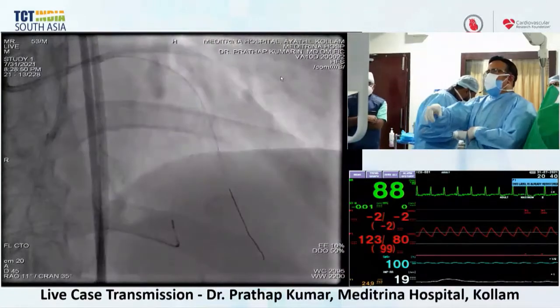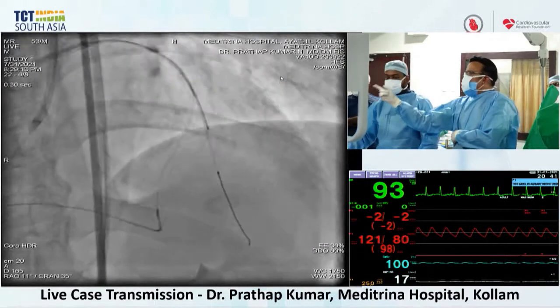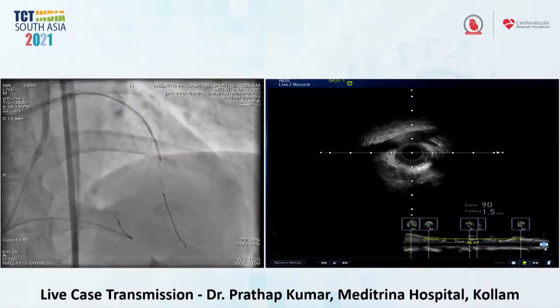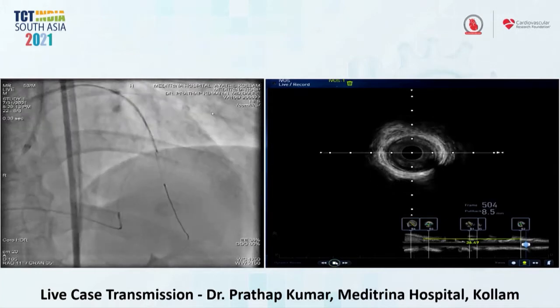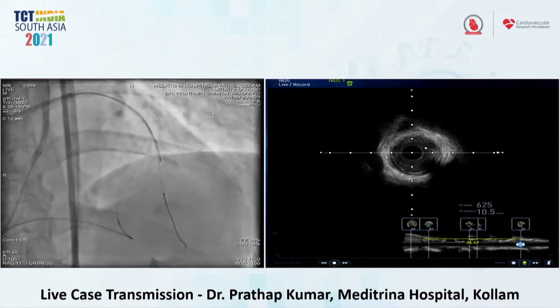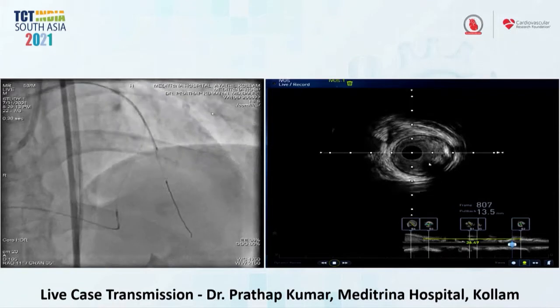Next, we took IVUS. This is IVUS. Can you just show the IVUS? Okay. Stalin, explain. On IVUS, we can see the distal LAD is almost like a 2.25 with very minimal plaque, probably underfilled. Yeah. Now we can see some significant disease over there.